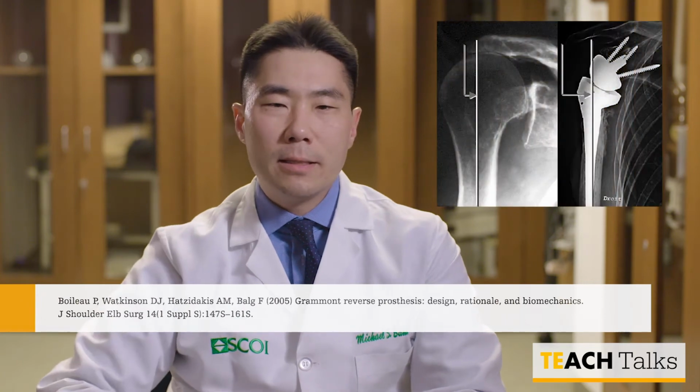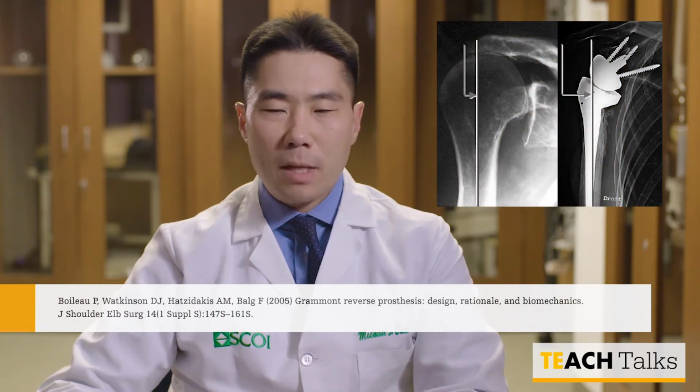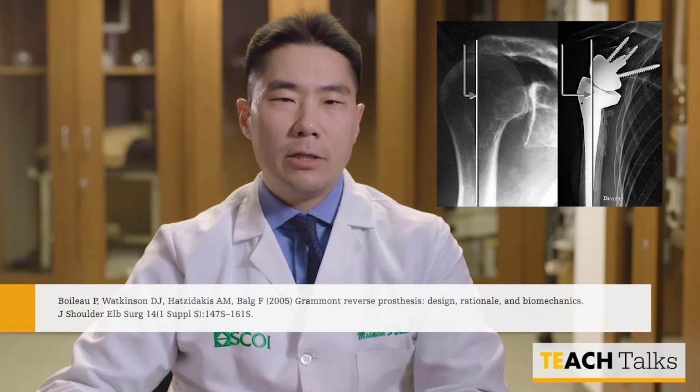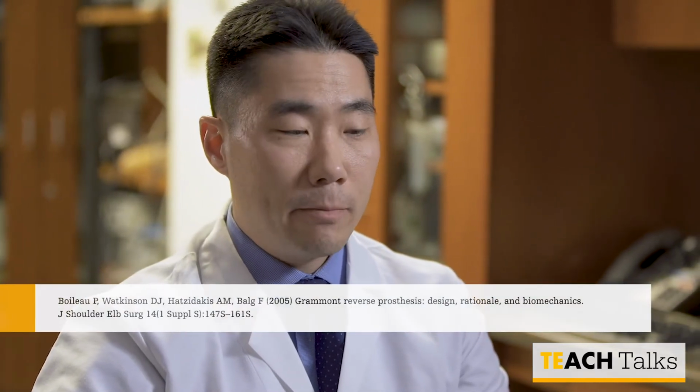And what that does is, because it's a non-anatomic medialized center of rotation, certain intact soft tissues, namely the posterior rotator cuff, may be detensioned, and it may not be able to work at the ideal length. Practically speaking, that means that we can't get as much active external rotation as we want. And that's a very important feature.